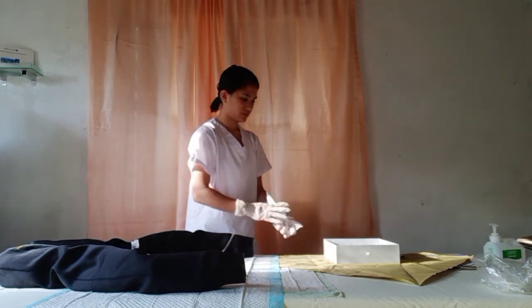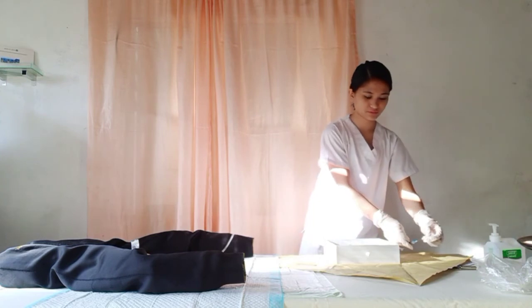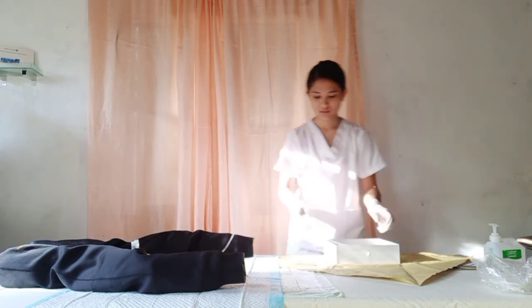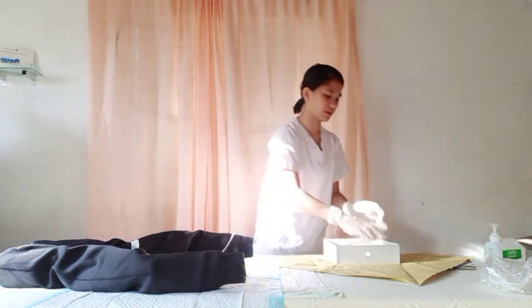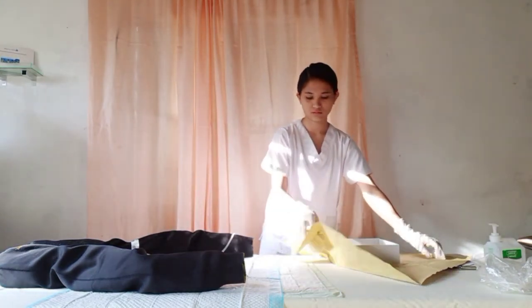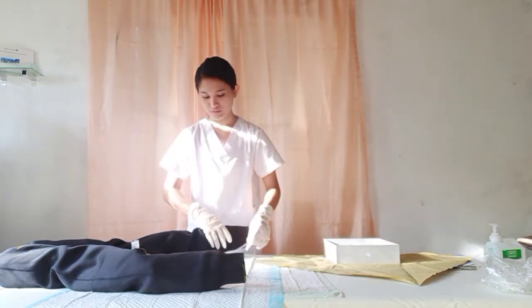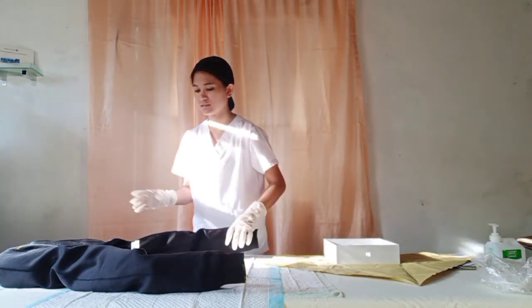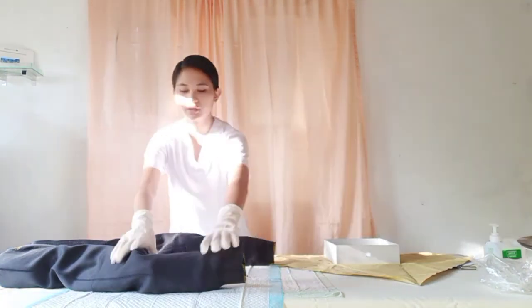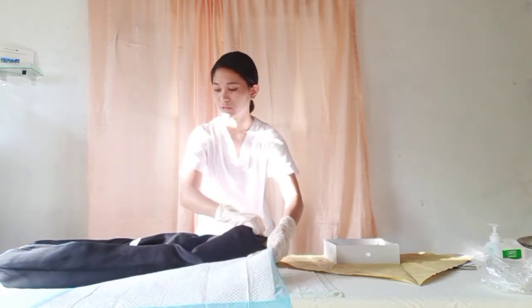Mrs. Cruz, you did great. How are you feeling, Mrs. Cruz? Okay, that's good. Collect specimen if necessary. Mrs. Cruz, I placed the call light within your reach, so you can easily call me if you need help. Excuse me, I need to get the drip.